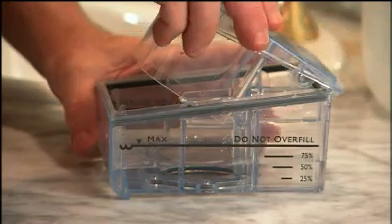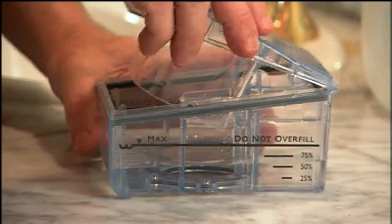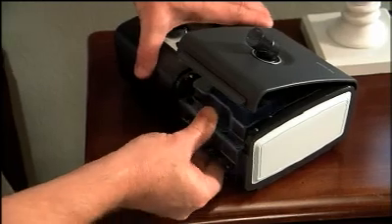Reassemble the water tank by placing the hinges on the lid over the two tabs on the back. Close the lid securely. You should hear it click into place. Now insert the water tank back into the humidifier and close the door.